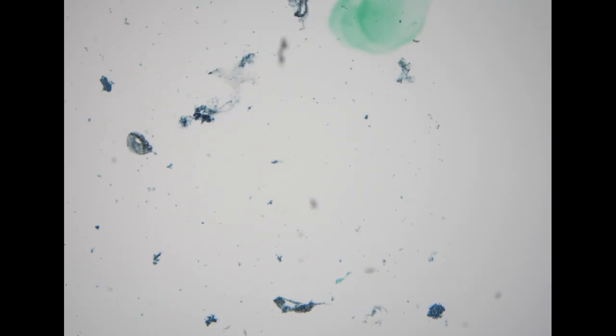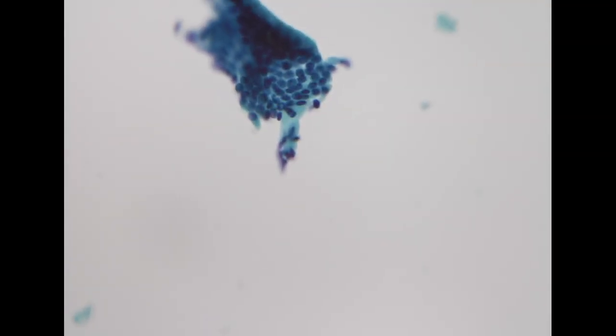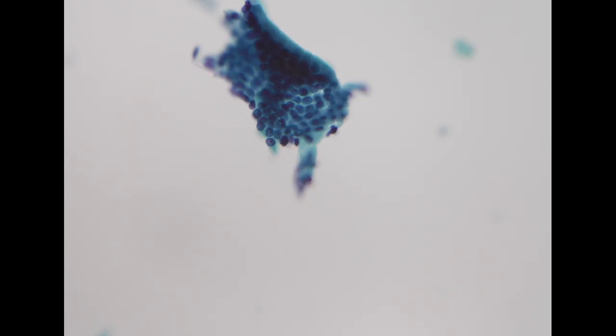So let's move to the FNA specimen. This is the EUS-guided FNA. We're starting to perform liquid-based cytology on this type of specimen. Here you can see more like benign ductal cells with a beautiful luminal border.